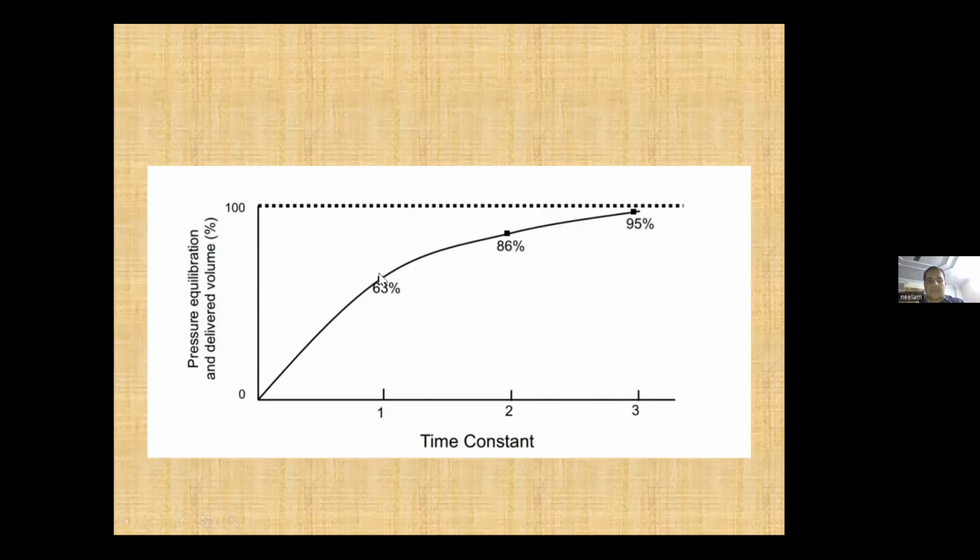तो अगर मैं एक टाइम कांस्टेंट जितना ही अपना इंस्पिरेटरी टाइम रख रहा हूँ, सपोज इस बेबी का टाइम कांस्टेंट है 0.1 सेकेंड, ठीक है. So if I keep the inspiratory time of 0.1 seconds, होगा क्या कि 20 centimeters of water जो pressure है उसका 63% means somewhere around 13 centimeters of pressure only will be delivered to the baby's lung.